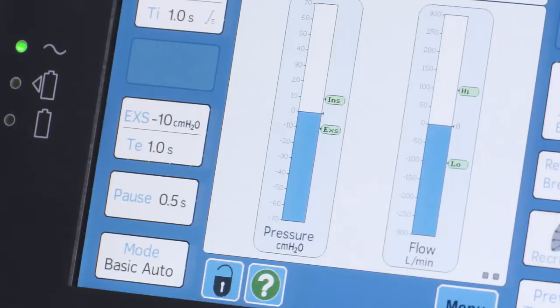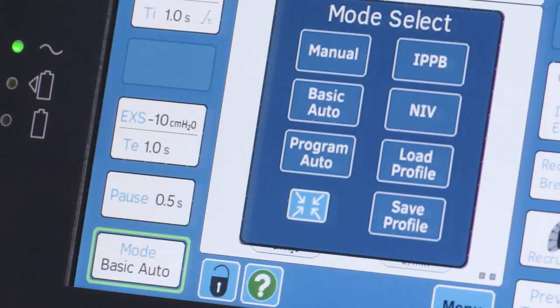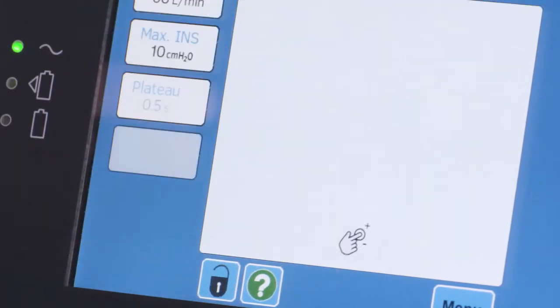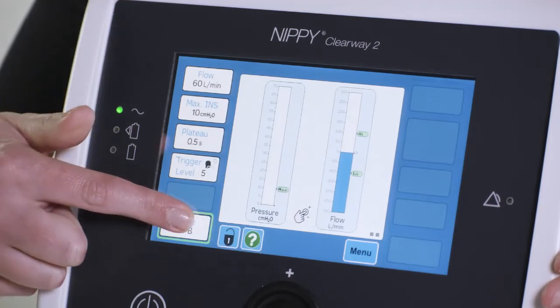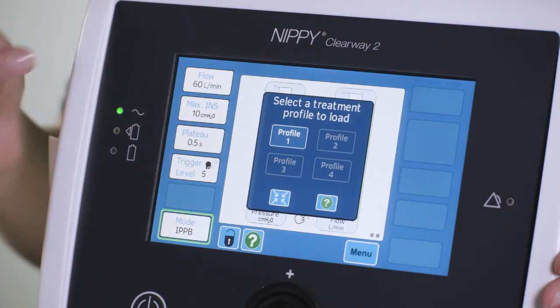Select the required mode on the Clearway 2 by pressing the mode button in the bottom left hand corner of the screen, then selecting the mode. If you are using a saved treatment profile, press load profile and then select the required profile.